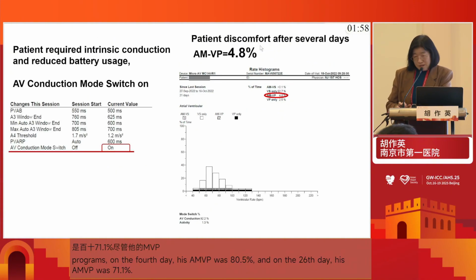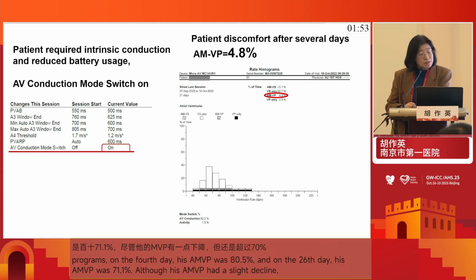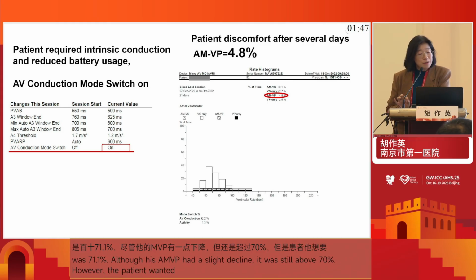But the patient said he wants to reduce the battery use. He wants longevity of the battery and requires intrinsic conduction.